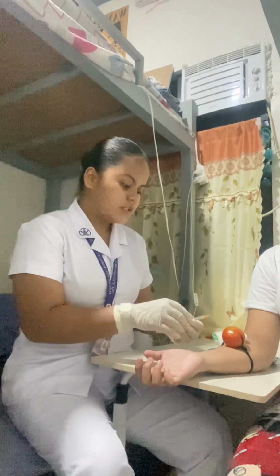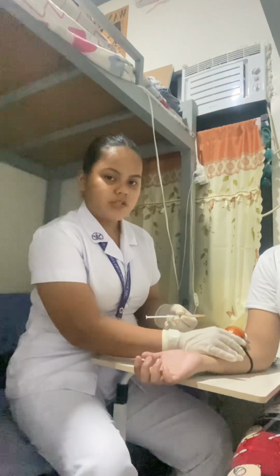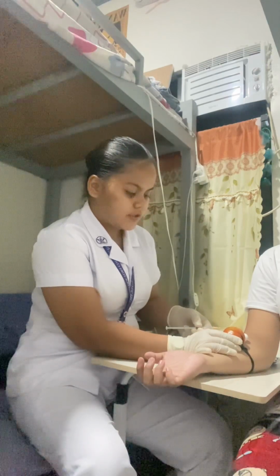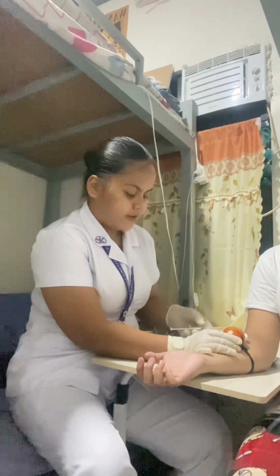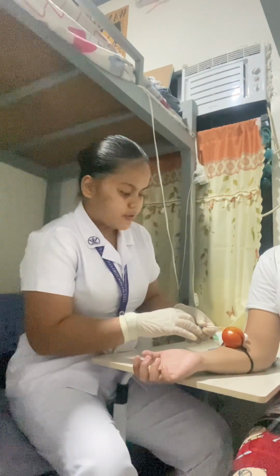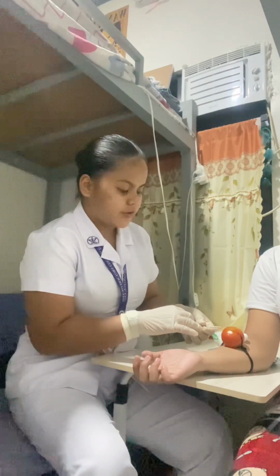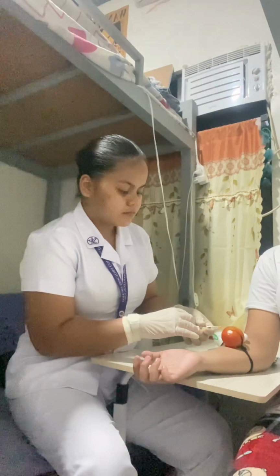So using my non-dominant hand, I'll be pinching the skin like this, and then slowly insert the needle. After that, I'll move my non-dominant hand and push the plunger slowly. So pushing the plunger slowly will help to reduce discomfort to the client and minimize the stinging sensation.